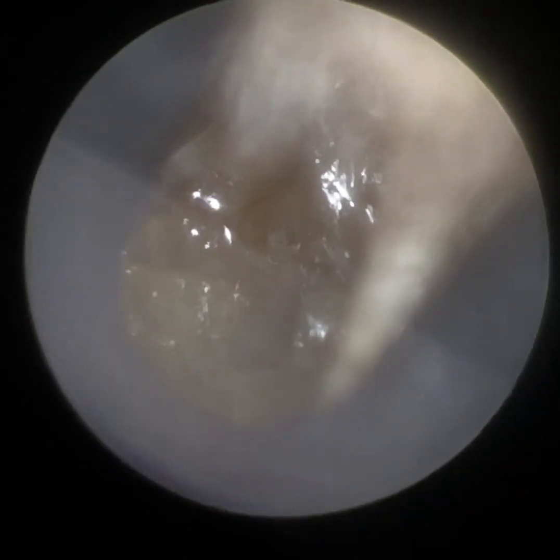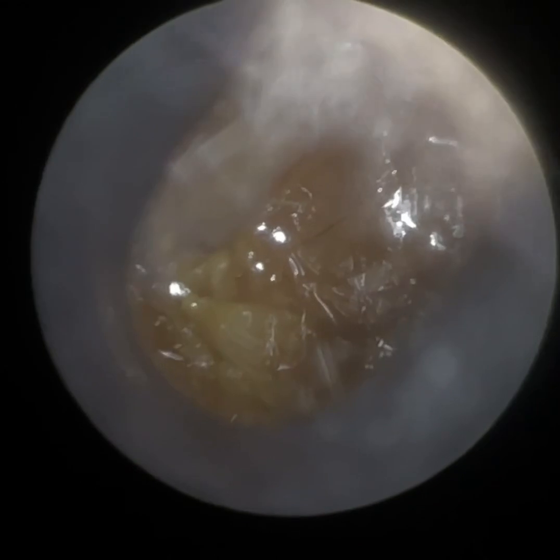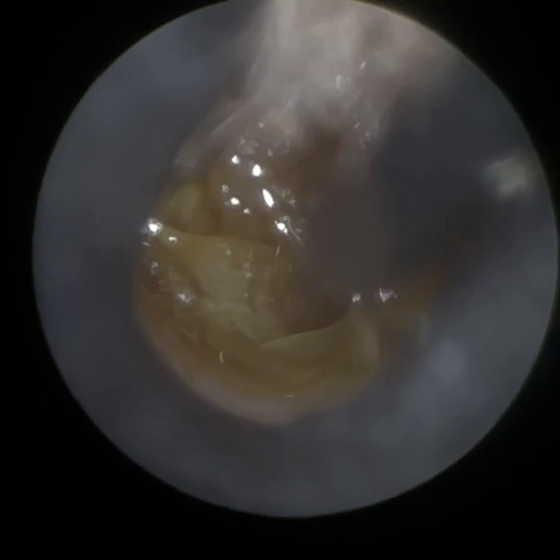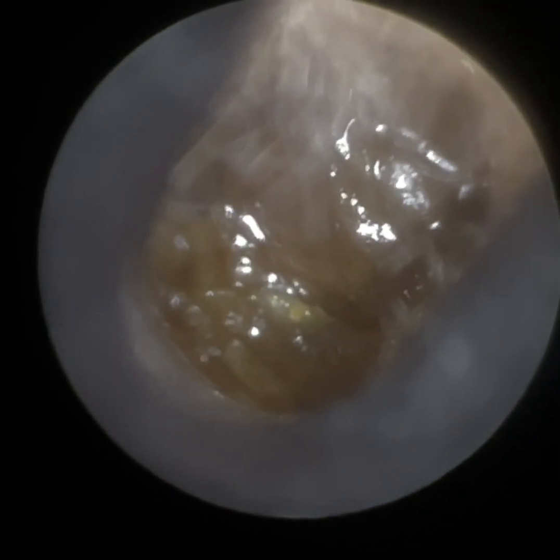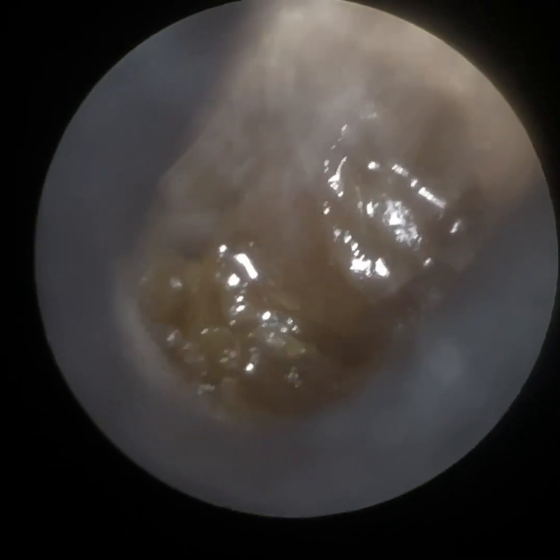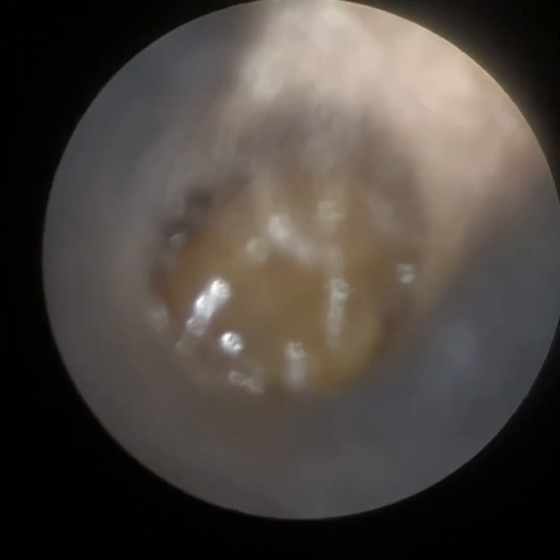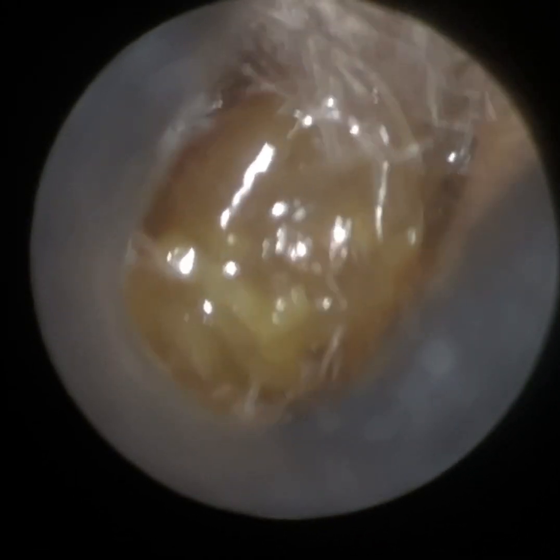The location of this wax, because it is on the eardrum, and being a child, I've got a very narrow ear canal. So I've just got the optimal view here, and I'm just using a fine-end suction probe. I just removed that away somewhat from out of the inferior recess, and the patient moved. So I just came out as quickly as I could to reassure the child. As I was removing this, the patient moved again, but slowly but surely we're bringing this out of the ear. So this was lodged right up against the eardrum.